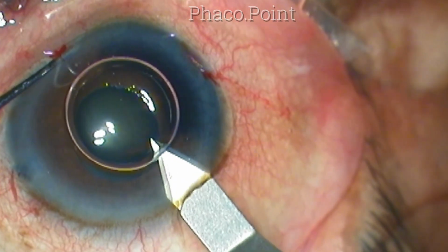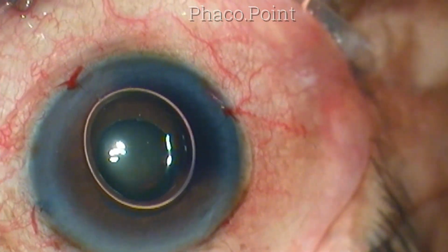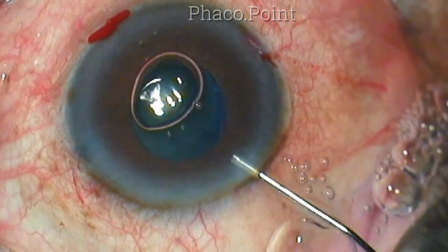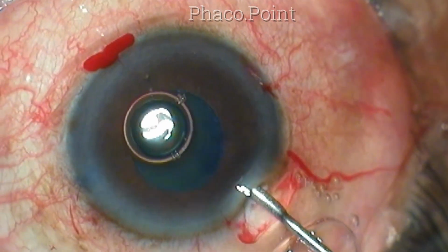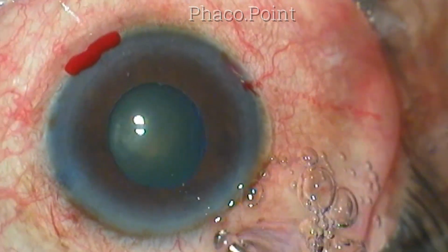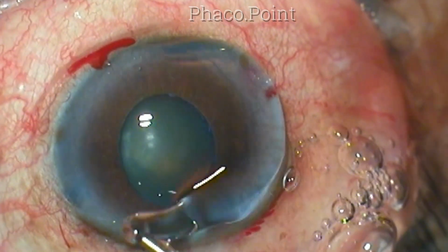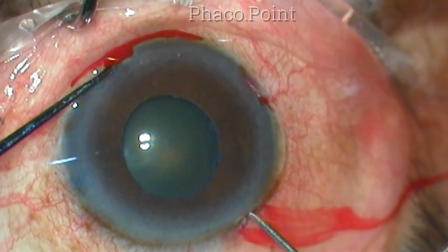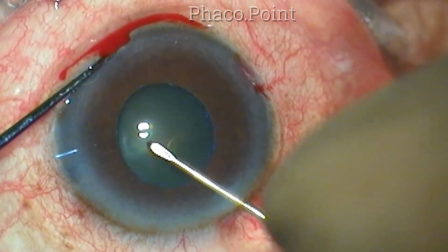Pay attention to the clear corneal incision because a poorly constructed incision will lead to iris prolapse. Always wash off the trypan blue from the anterior chamber before filling it up with viscoelastic because this will enable you to get a much clearer and crisper view of the anterior capsule while performing capsulorhexis.